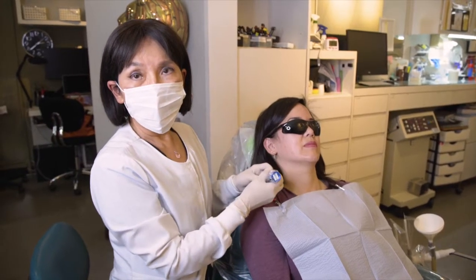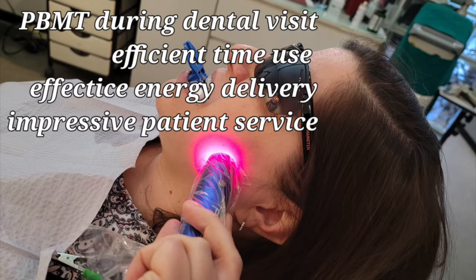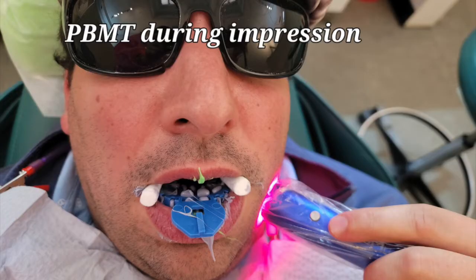During the procedure, when the mouth gets tired — for example while we're taking an impression — the patient can hold the light again on the jaw joint on the right side and the left side while we have that three-minute waiting time for the impression to set.